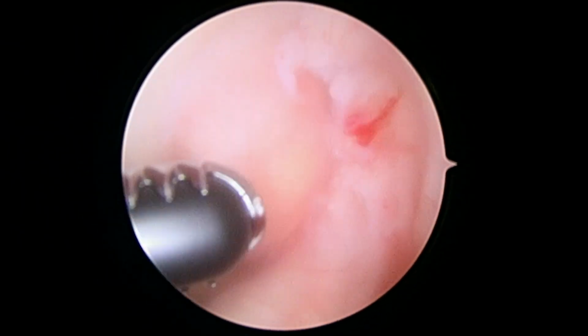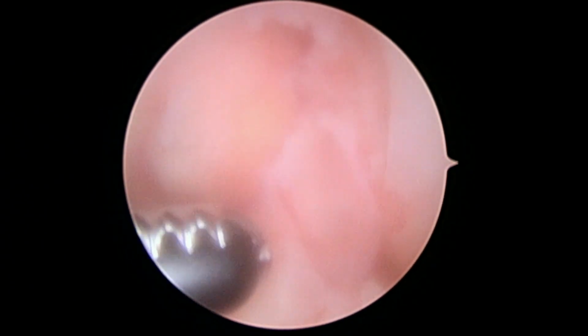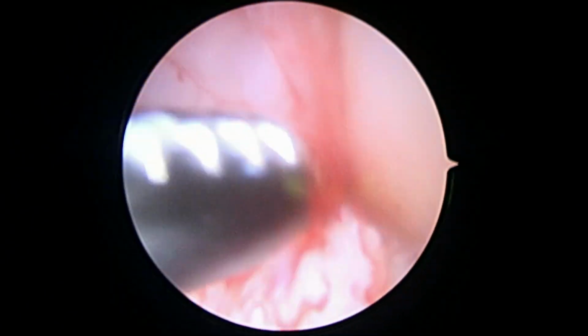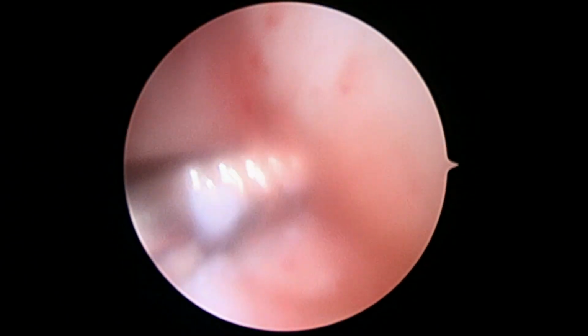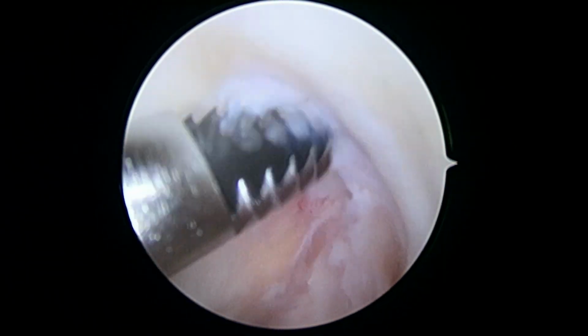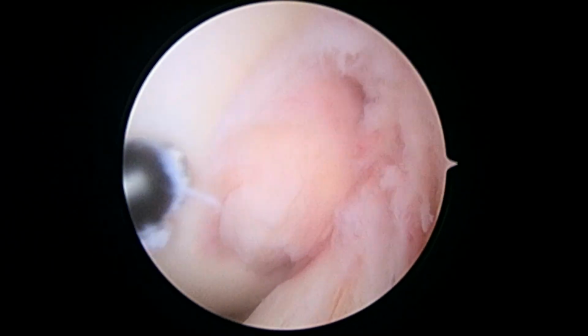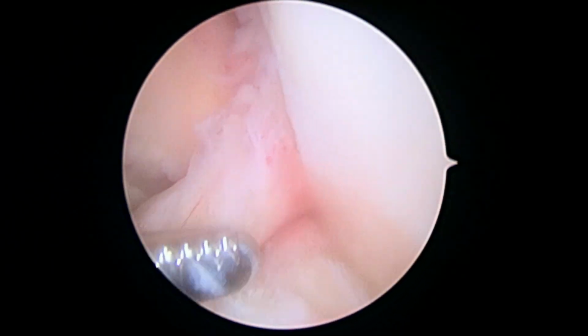Okay, so this is the central part of the knee. That's your anterior cruciate ligament just behind the shaver here running up. So far so good. No signs of any tearing there. There's a little bit of bleeding. That'll stop in just a minute. Your posterior cruciate ligament inserts on the femur just to the left of that shaver, and that looks good also.